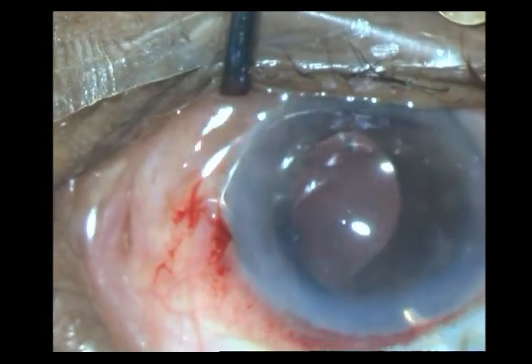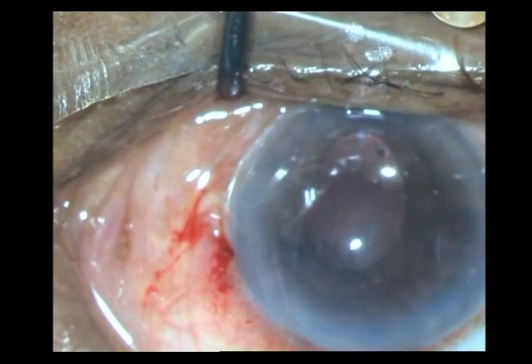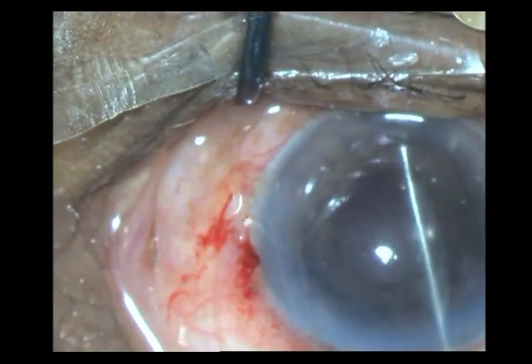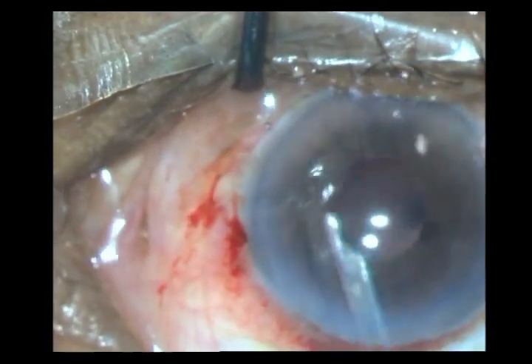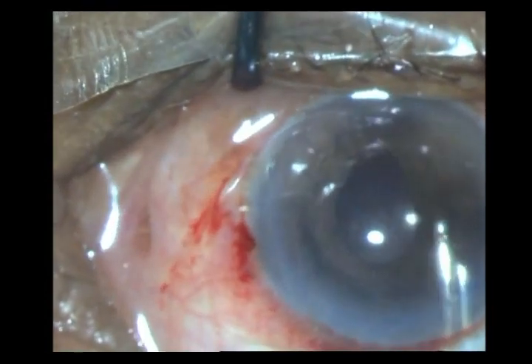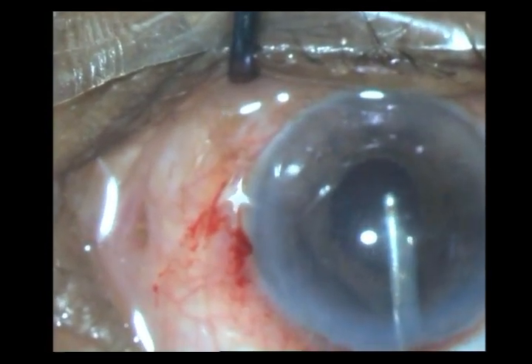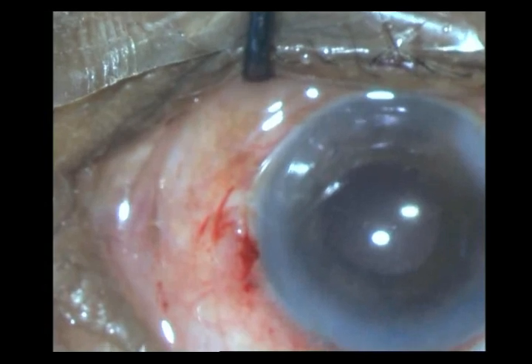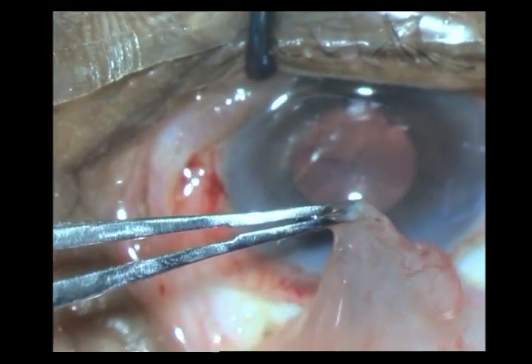I am just bending it and getting it into place — and there it is. Don't manipulate too much. I bring down the iris onto the IOL; it is pretty round, more than enough for me. I then aspirate, trying to aspirate in the periphery as well to bring out any debris or exudates that may be present. I then hydrate the wounds and close the conjunctiva by injecting subconjunctival fluid into the flap. I do not place any suture.